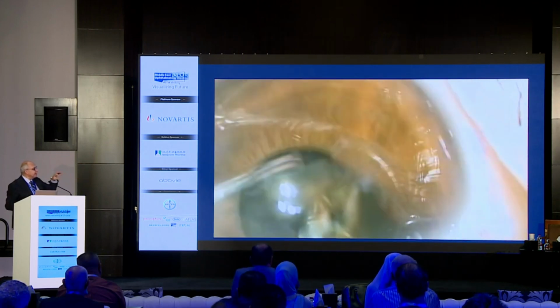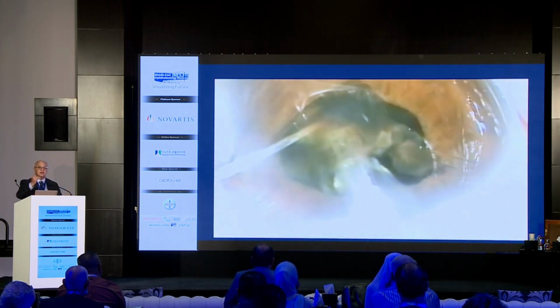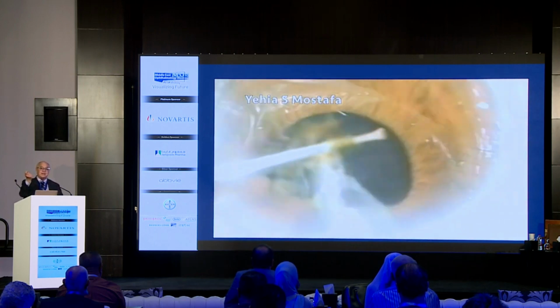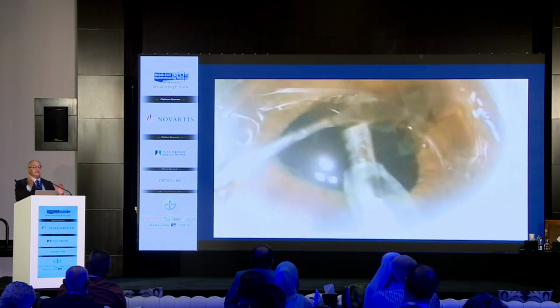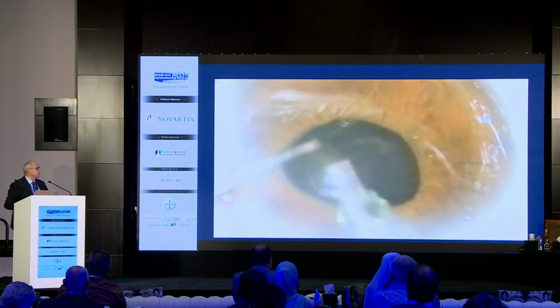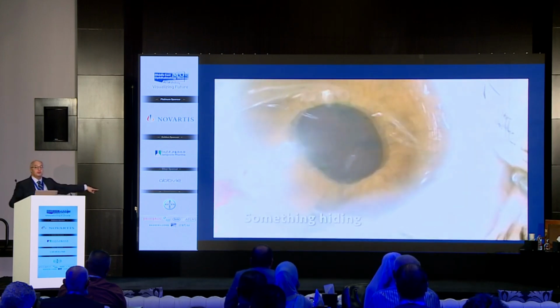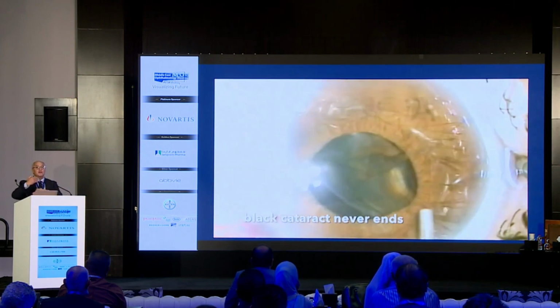And also you can almost always judge your effect on the corneal endothelium. If you're using methylcellulose or viscoadhesive, there are fine air bubbles that are entrapped in the back of the cornea, and if you see them not moving so much, then you are safe on the cornea. And you can see also there is no wound burn, and this is due to the proper interruption of the ultrasound.